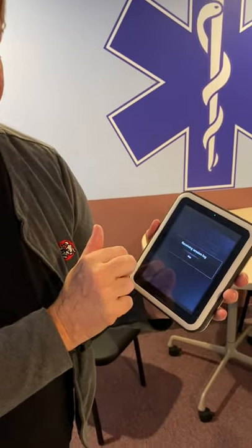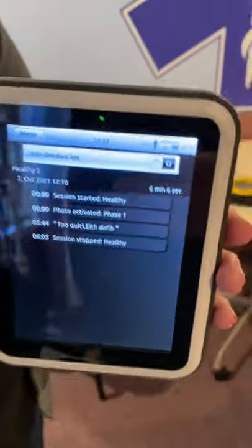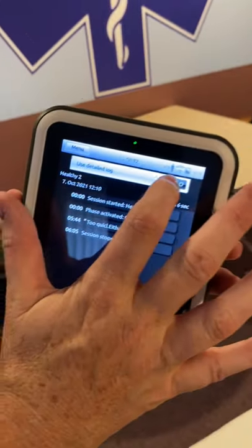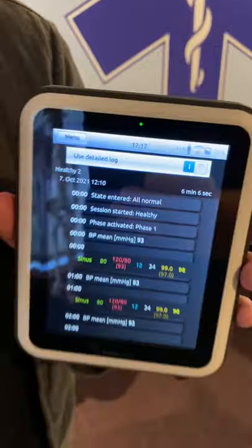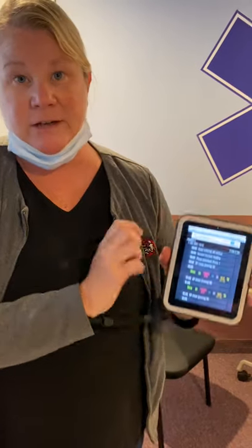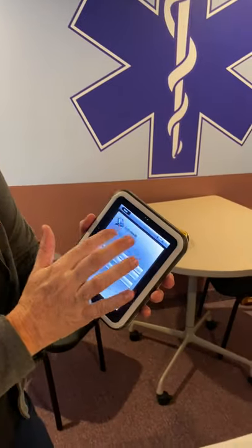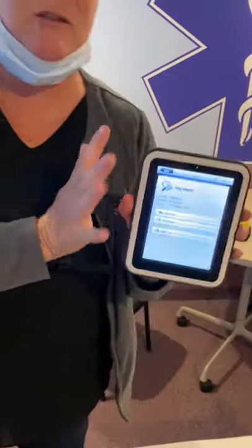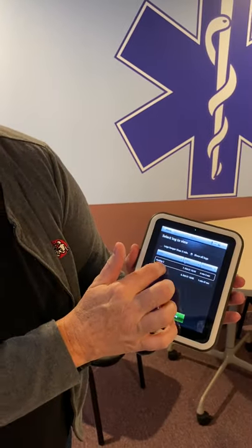If you hit View Log, it's going to automatically bring that log up and show you the details of what happened. If you want a detailed log, it's going to give you the vital signs that were happening during the scenario at certain times, so you can have that dialogue with your students. All of this information can be saved onto a computer or external drive, displayed on a screen, or printed out so you can debrief with your learners as you see fit. All your logs are saved here — it'll save thousands of logs — and you can select any prior log to review with a specific student.